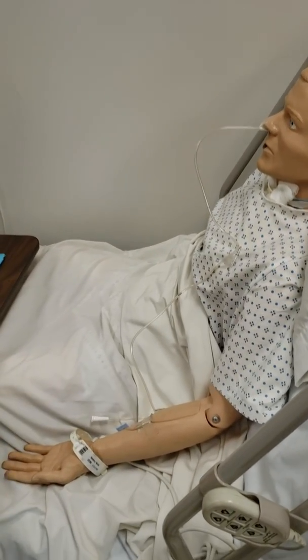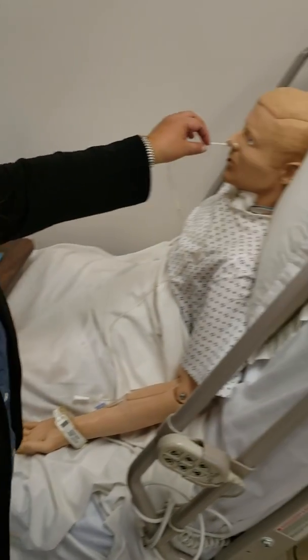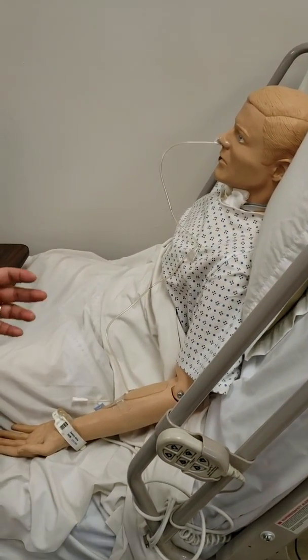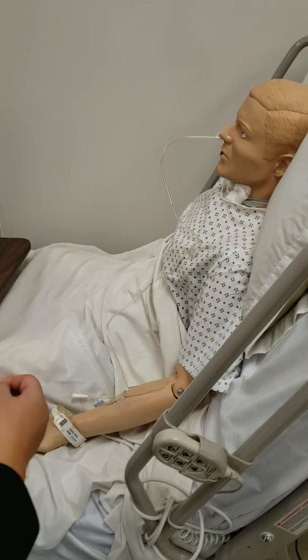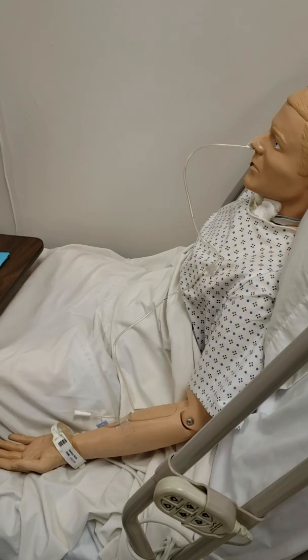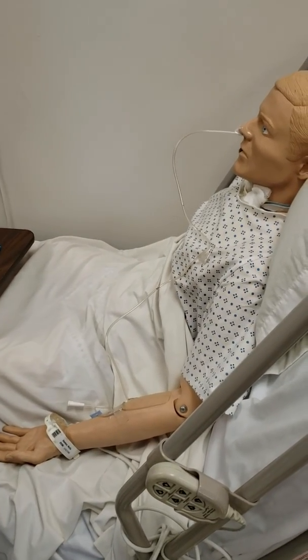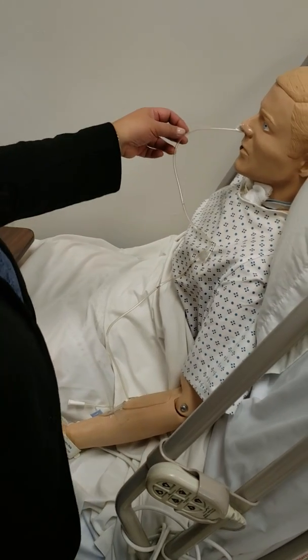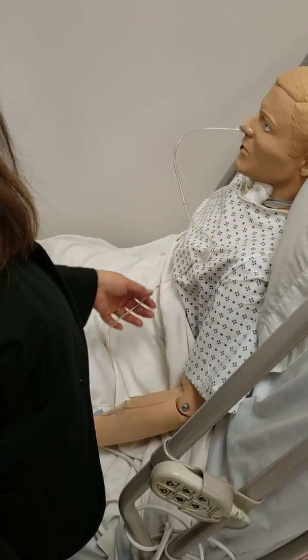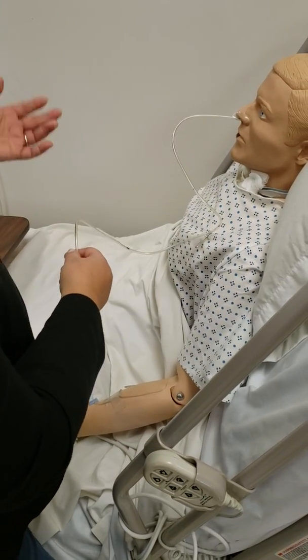So you have to make sure that you check it, because if it moved further out, then it's out of the stomach. You need to probably move it further down. So you tell the teacher, I'm gonna check if the length is correct based on the documented length.